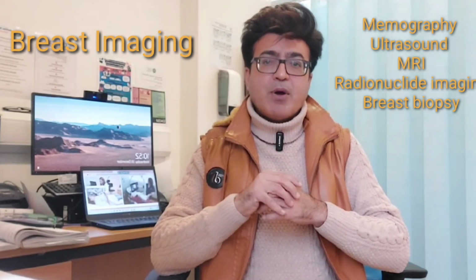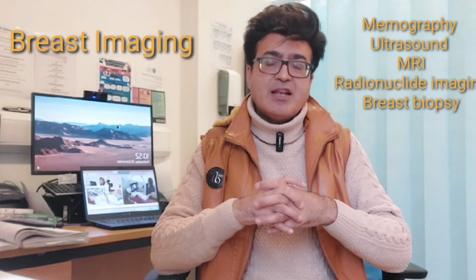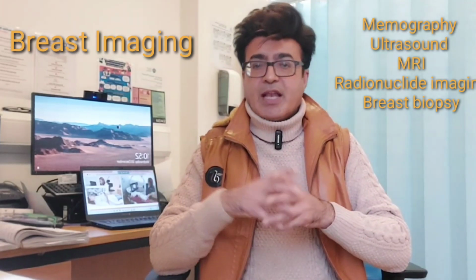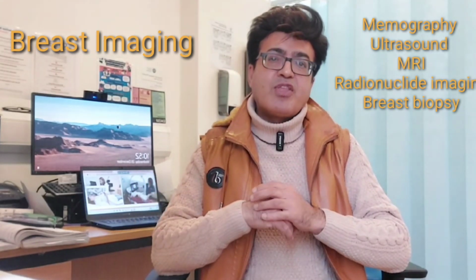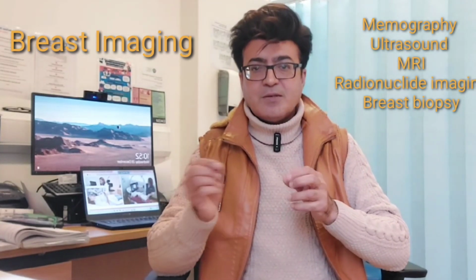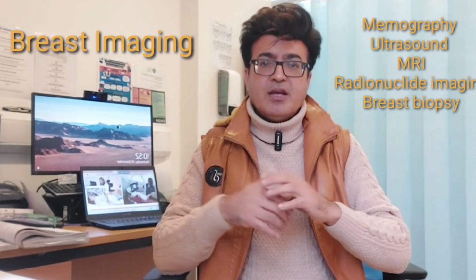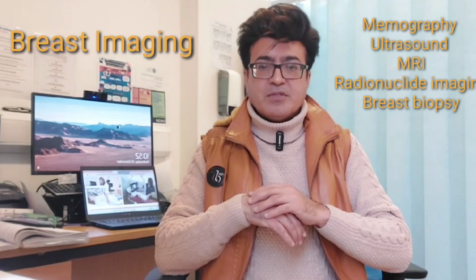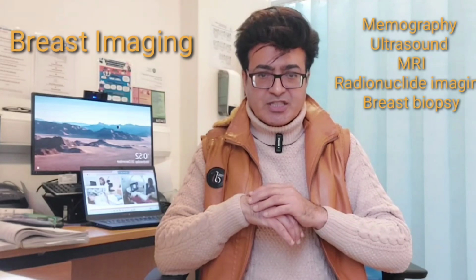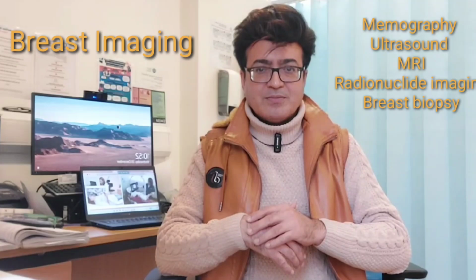After that I will discuss ultrasonography, how it will appear on ultrasound imaging. Then we will discuss biopsy, radionuclide imaging, and MR as well. Some of the features of MR will also be included in this video. Hopefully, once you go through this video, you will be able to grasp the idea of how many types of diagnostic tools are available to diagnose breast lesions, and I hope you will enjoy this video. So let's start watching these images.